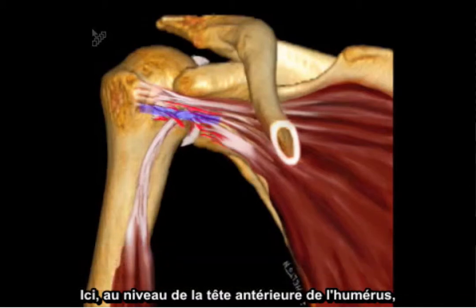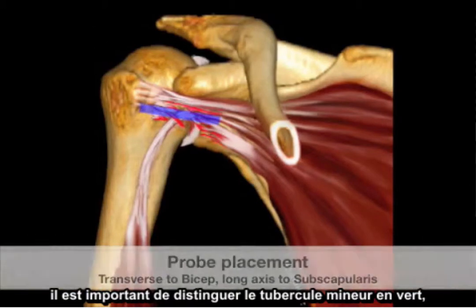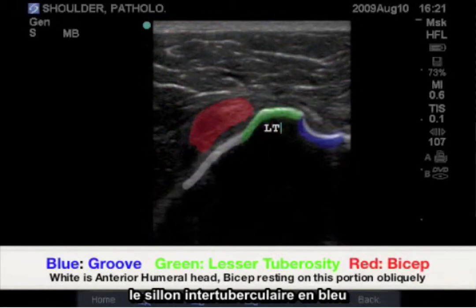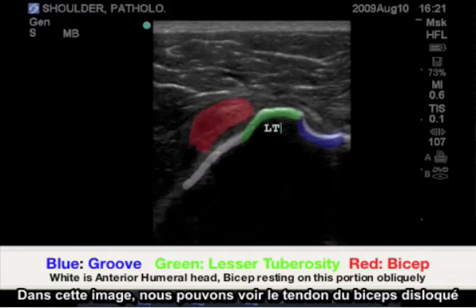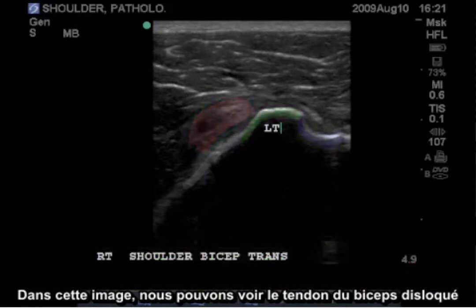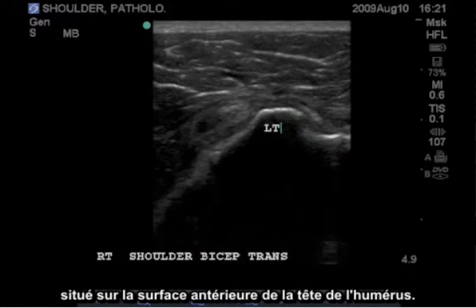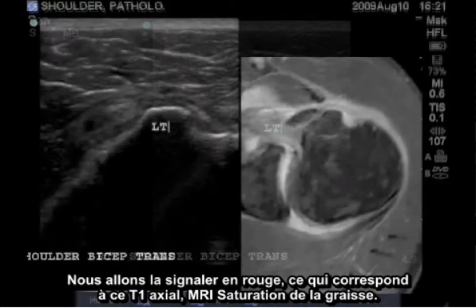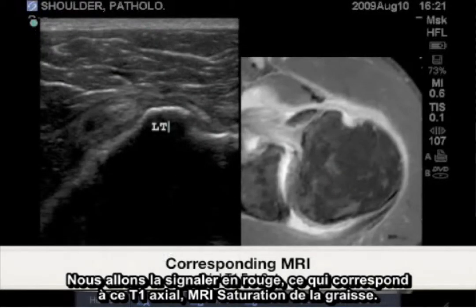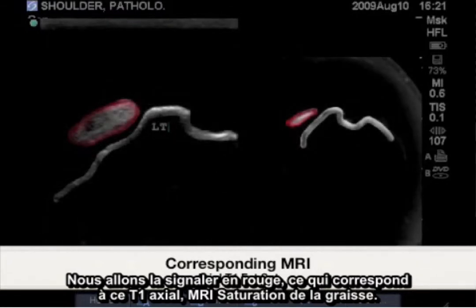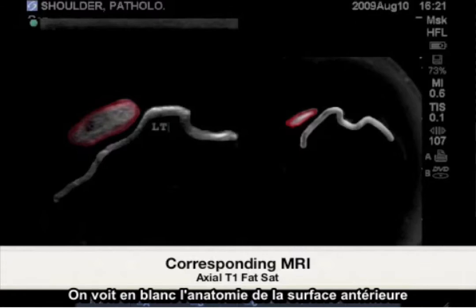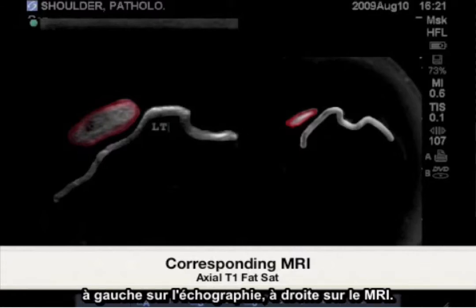Here at the anterior humeral head, it's important to recognize the green-marked lesser tuberosity, the blue bicipital groove, and the white anterior humeral head. In this image, we have a dislocated bicep tendon located over the anterior surface of the humeral head, highlighted in red, corresponding with this axial T1 FATSAT MRI. Highlighted in white are the anterior surface anatomy, as seen on the left with ultrasound and on the right with the MRI.